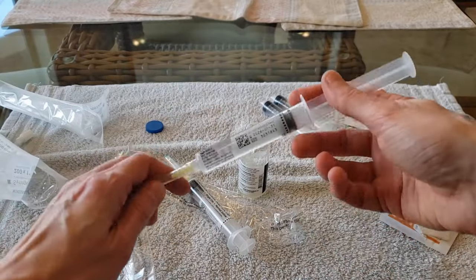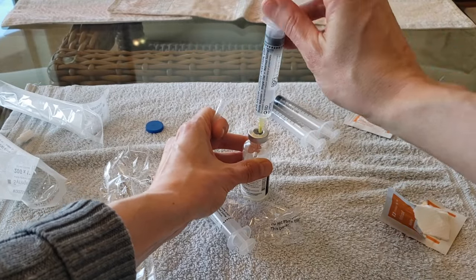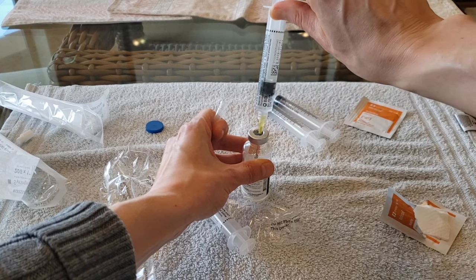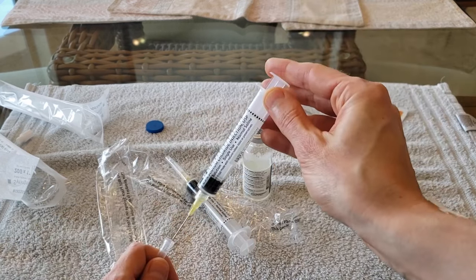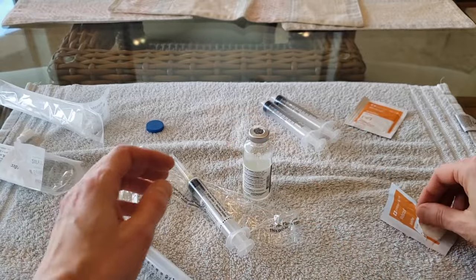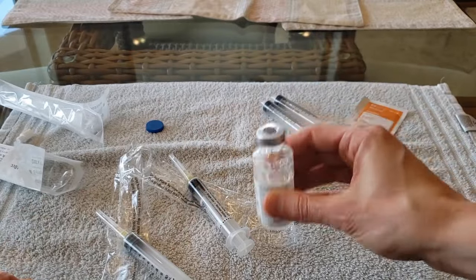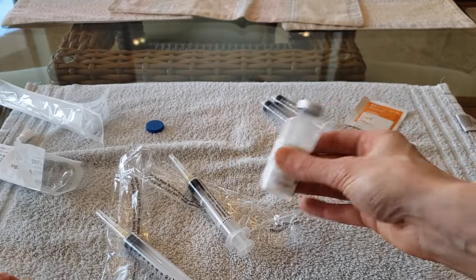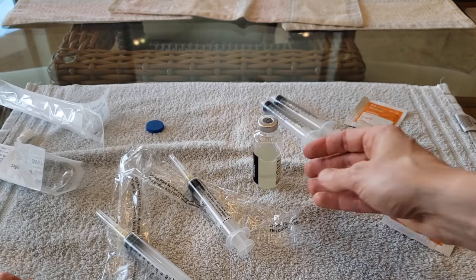I shake the vial to mix the saline. Next, I remove the cap from the needle on the other saline flush and infuse it into the vial. I remove the needle from the vial, place the cap back on the needle, and set down the empty saline flush. I then wipe off the top of the vial with an alcohol wipe and shake the vial to mix the saline with the powder. Once all the powder has dissolved in the liquid, I set down the vial and allow the solution to rest for about a minute.